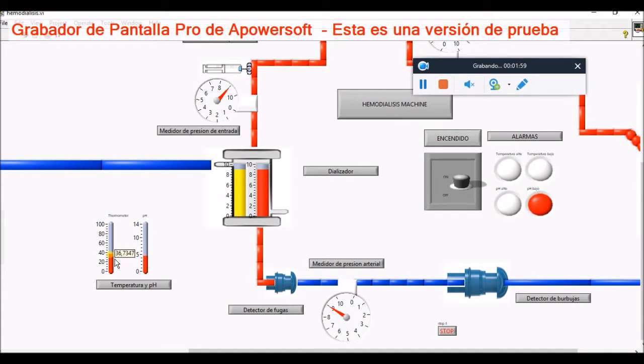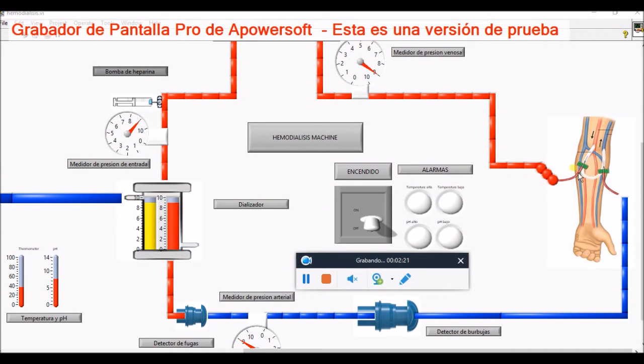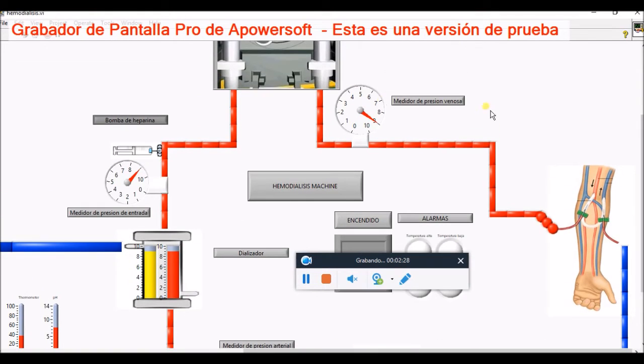Implant and graft, an artificial vessel that connects the artery and the vein. Arteriovenous fistula. Patients who require long-term dialysis may be candidates for placement of an arteriovenous fistula or graft. Arteriovenous fistulas or grafts create permanent high blood flows. Arteriovenous connections can be accessed using large bore needles to perform dialysis.